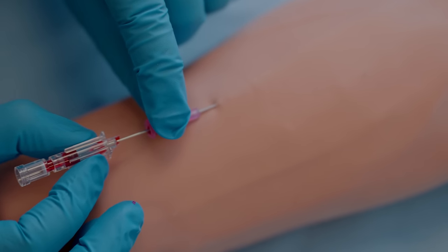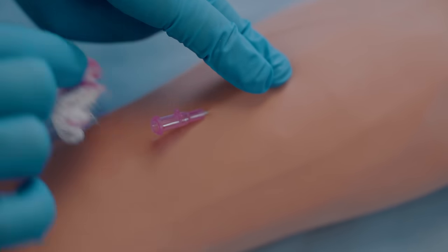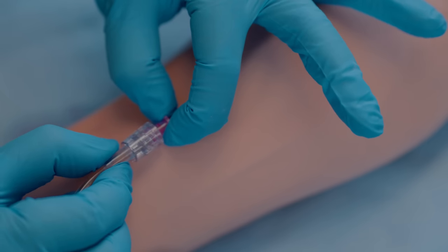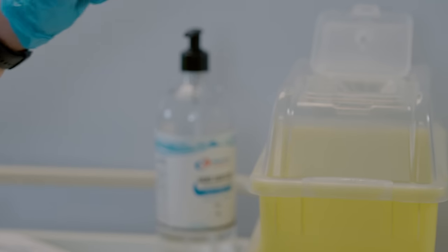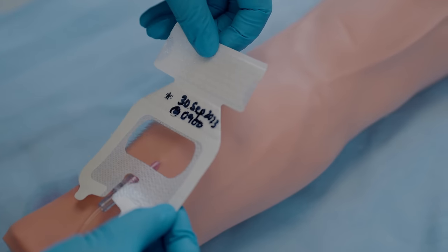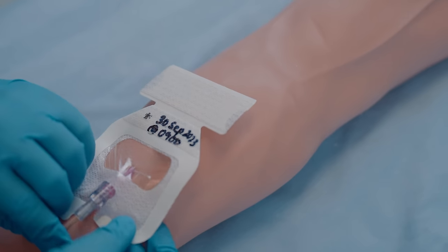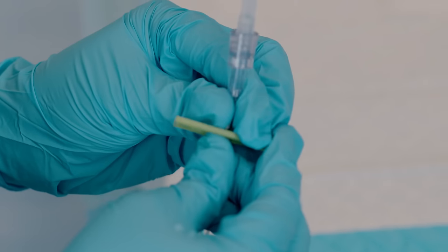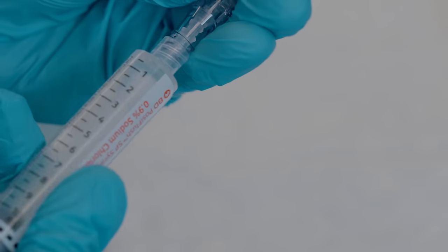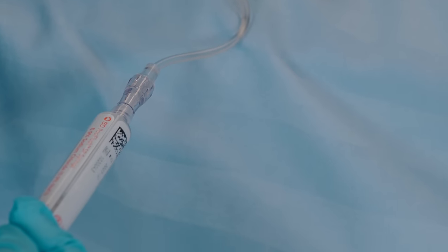Once the flashback of blood is seen, progress the entire cannula further, then fix the needle and advance the rest of the cannula into the vein. Release the tourniquet and apply pressure to the vein at the tip of the cannula, then remove the needle carefully. Remove the cap from the needle and put it on the end of the cannula. Carefully dispose of the needle into the sharps bin and apply the dressing to fix the cannula in place, ensuring the date sticker has been completed and applied.